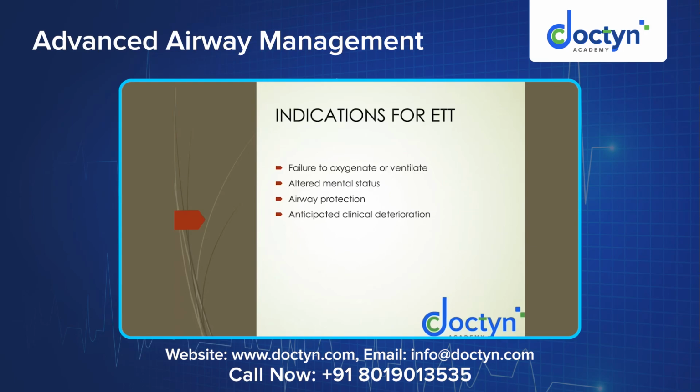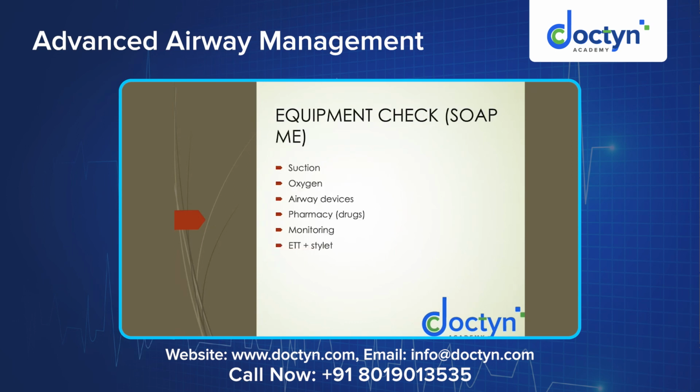So the indications: altered mental status, protection of airway, anticipated clinical deterioration, failure to oxygenate or ventilate. When you are planning an intubation for any patient, you always have to have a checklist in mind of whether all these are there. If any of these is not there, you would prefer waiting for them to be arranged and only then start the intubation process. Because why? I'll tell you the importance of each aspect.